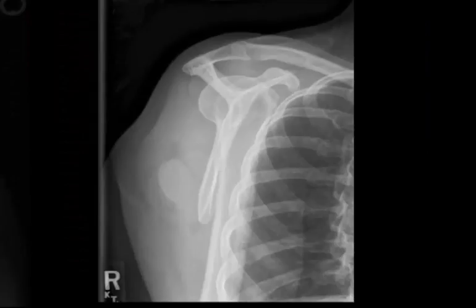Here, we have very similar production that we had with the PA. We have the acromion and coracoid processes. We also have the entire body all the way down to the inferior angle of the scapula. And once again, the humerus is almost in plane with the body of the scapula. This is the kind of separation that we want in between the ribs and the body of the scapula.